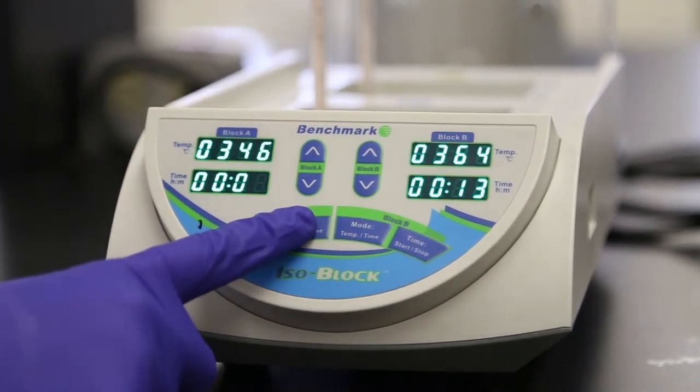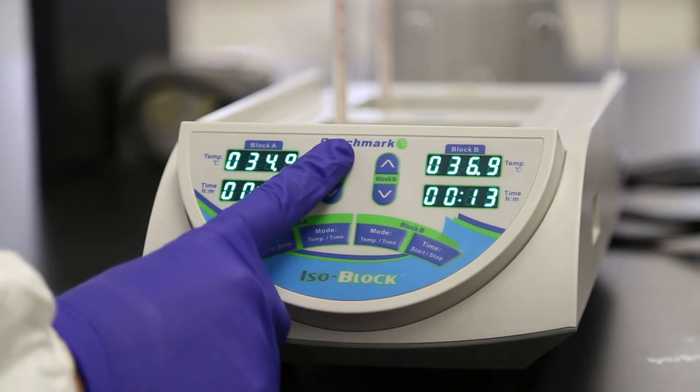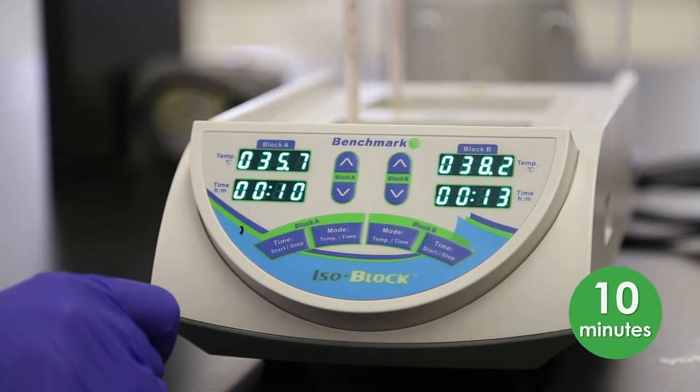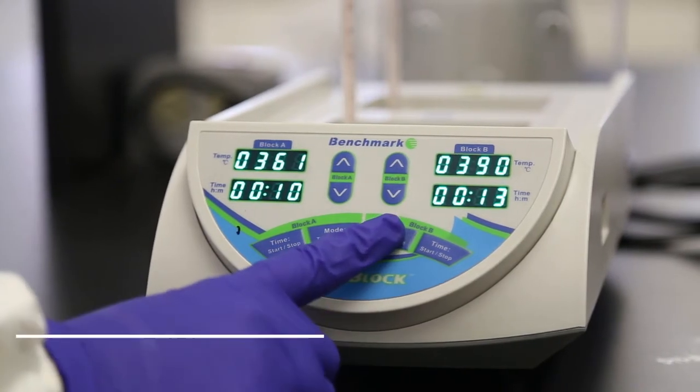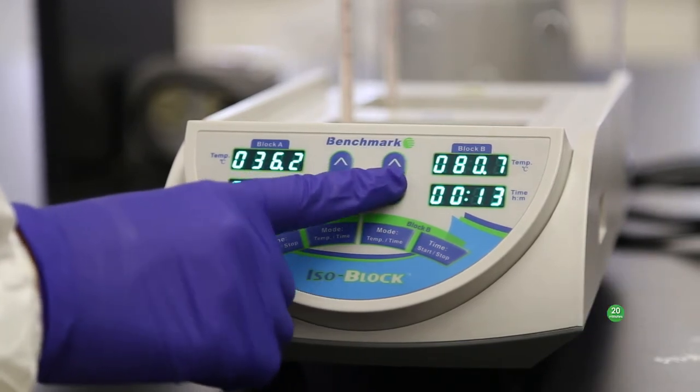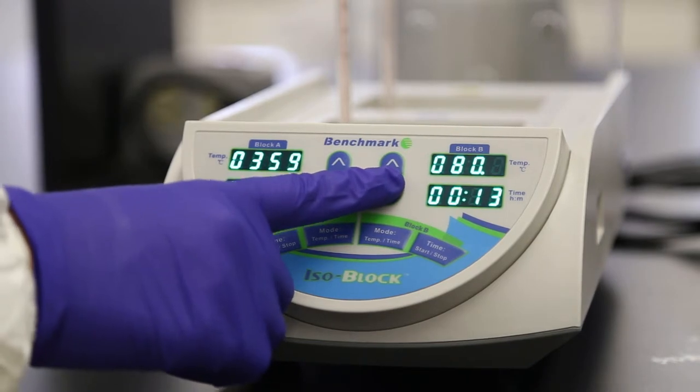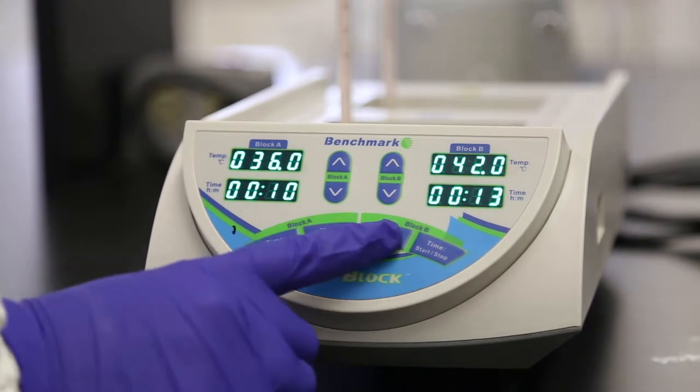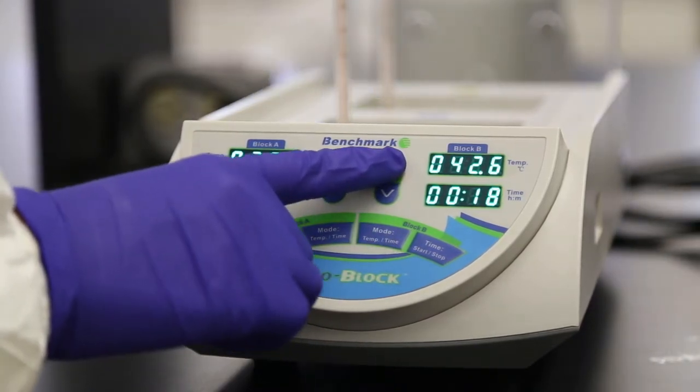To use the built-in timer, press mode temp time for block A twice to select the time setting. Using the block A arrow keys, set the timer to 10 minutes. Don't start the timer yet. Next, set the temperature for block B to 80 degrees Celsius and the timer for 20 minutes using the controls for block B. Again, the block will immediately start heating. Do not start this timer either.